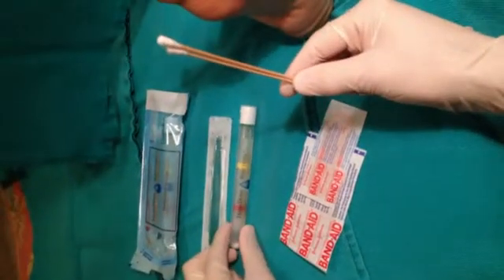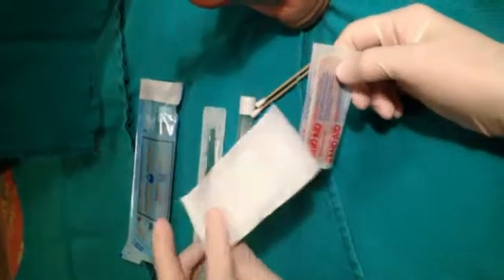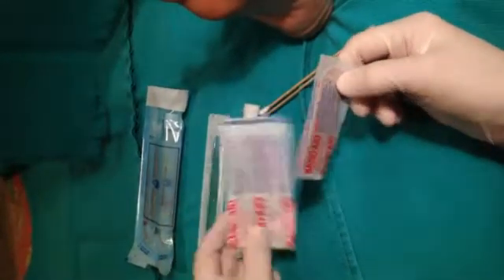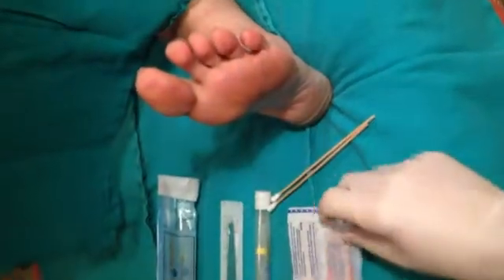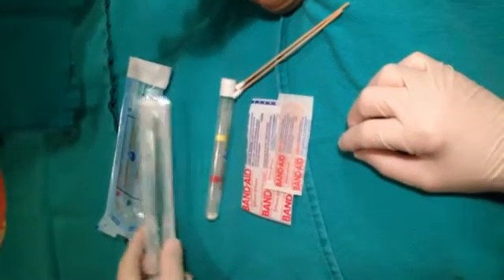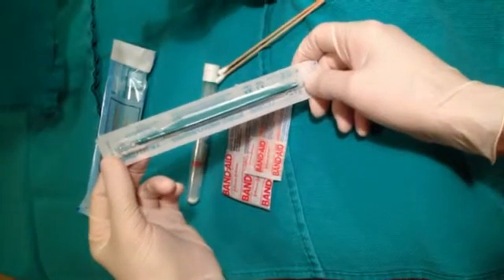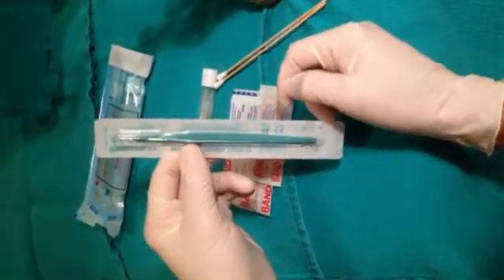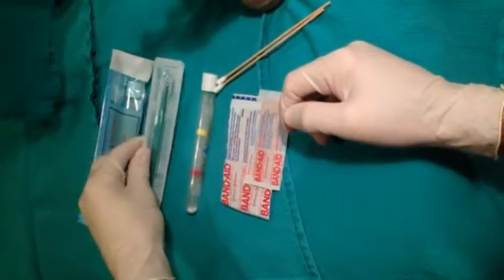The applicators are also included. We also have two occluding bandages — one large one for a large lesion or multiple lesions in an area, or a smaller one, which we will be using in this case to occlude this lesion at the end of the procedure. Also included is a disposable curette for debridement to be performed on this lesion in 24 to 48 hours — we will be doing it in approximately 24 hours.